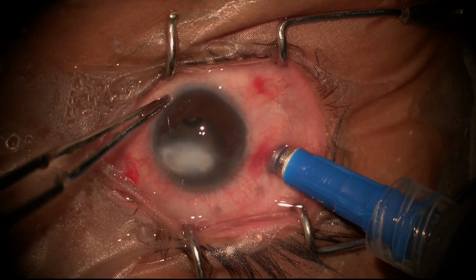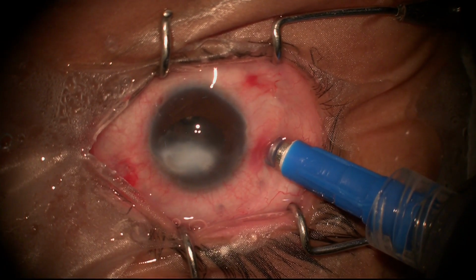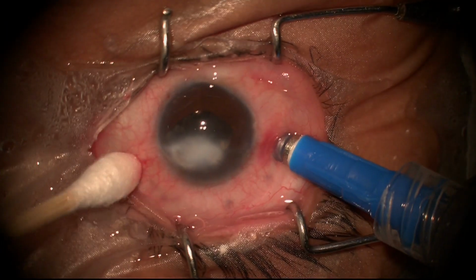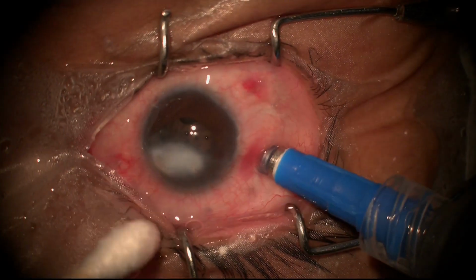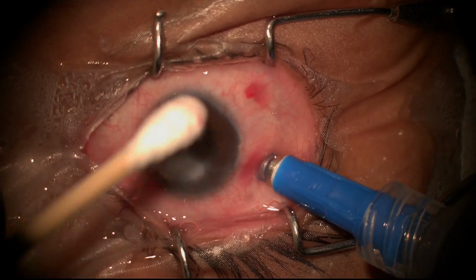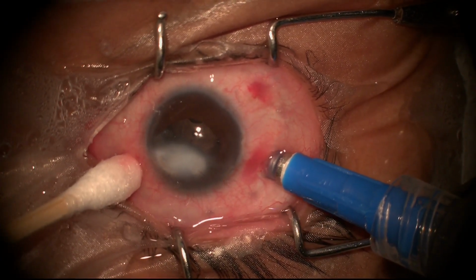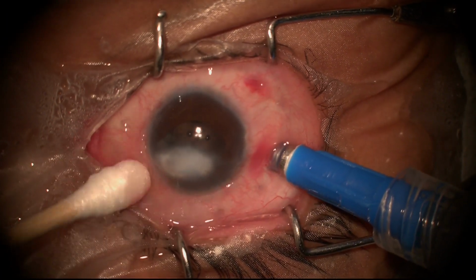By indenting, you know how much pressure you have created. Soft stick. Our sclerostomies are well sealed. Pressure is good. Anterior chamber is not leaking. And I think retina is settled. Just a little bit more oil. That's good enough.